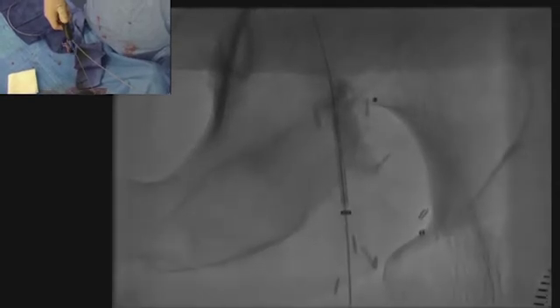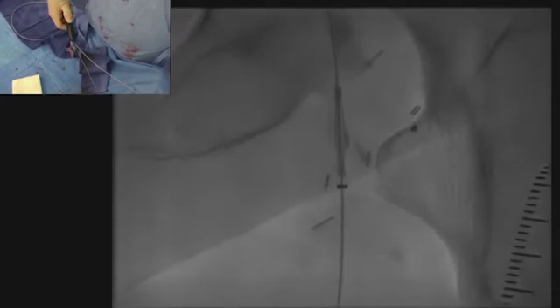And then above that is the native occluded popliteal artery. Now we are taking the device through the retrograde slender sheath, and here is the device positioned in the common femoral artery.